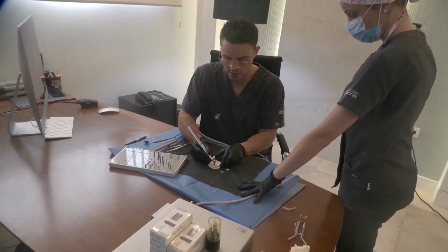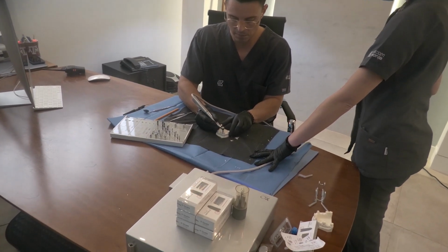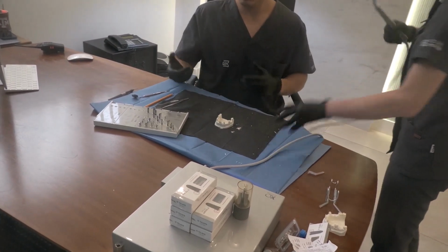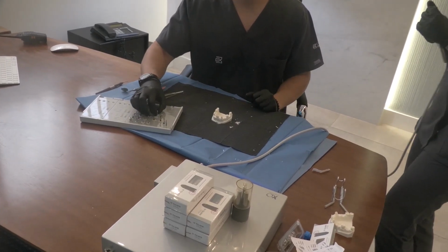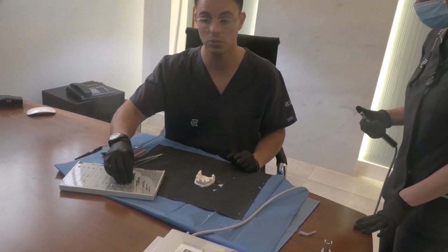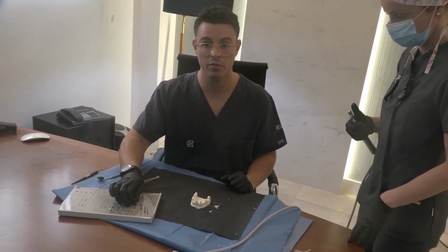Please follow the same sequence, right in the center. And now again, imagine that the bone is very dense. You can either go just for the 3.5 millimeter drill, or you can go for the profile burr.